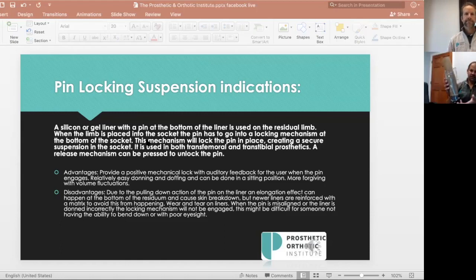I did an evaluation yesterday, and that exact topic came up. A young man who's now a right below the knee amputee is going to be weight bearing in his prosthesis, and his initial thought was, what do I have to do to toughen up the bottom of my limb so when I'm walking on my prosthesis I don't have pain? Well, that's not the point of wearing the prosthesis. That's not where we want your weight distributed, distally on the very bottom. We do want you contacting on the very bottom, because if we're not contacting, we create negative pressures which lead to other issues. But we want to incorporate a prosthetic socket, and this is where your clinician is important in educating and designing and performing their duty as a clinician to get you in the right type of socket.